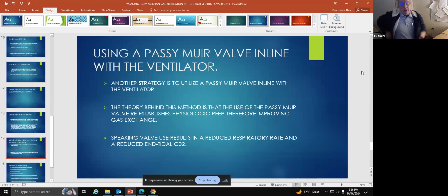And that's the same way with patients that are vent dependent. They haven't used those muscles. They've been laying in an ICU bed for who knows how long. So as the diaphragm gets stronger, they will be able to liberate from the vent, and yeah, so there's that.